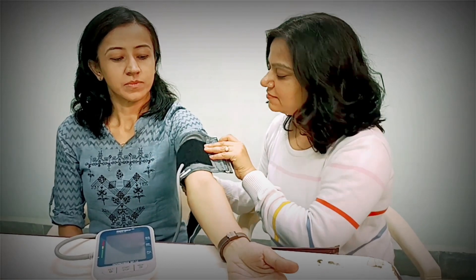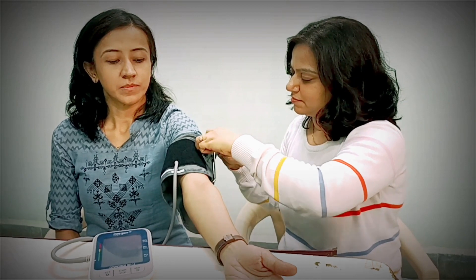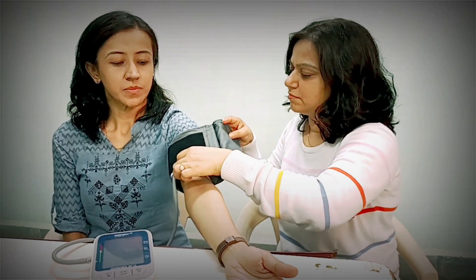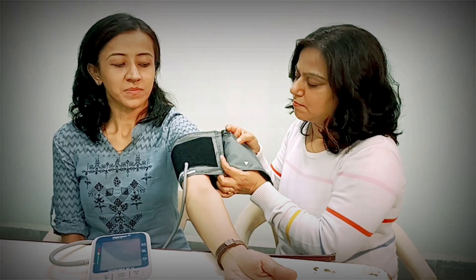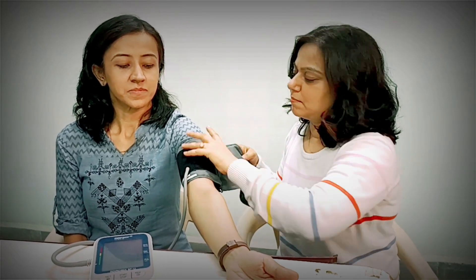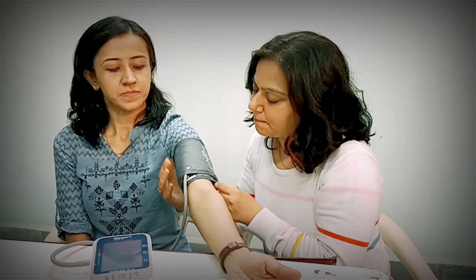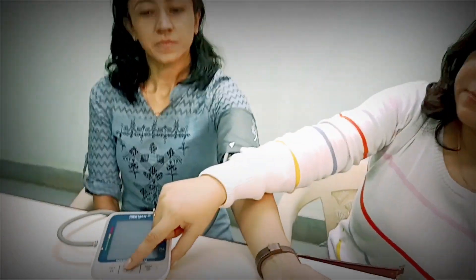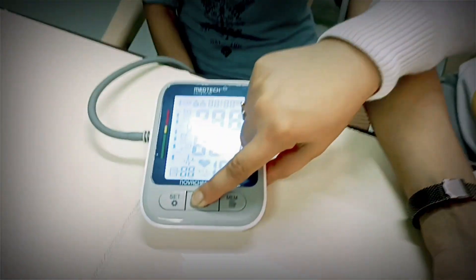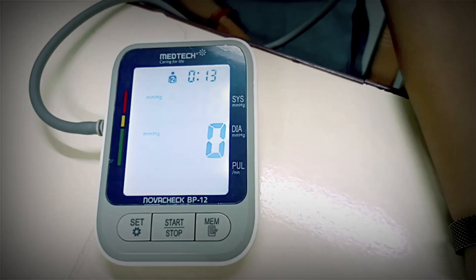Uncover the measuring site first. This is how you should place the cuff. Apply the cuff tightly. Then press the start button. It will cause automatic inflation of the cuff.